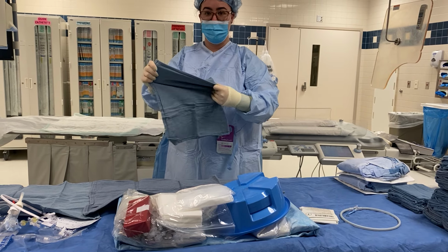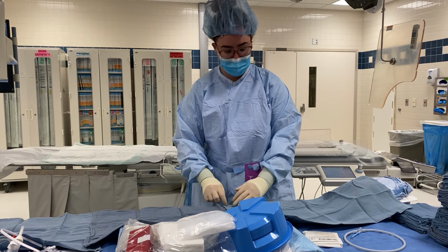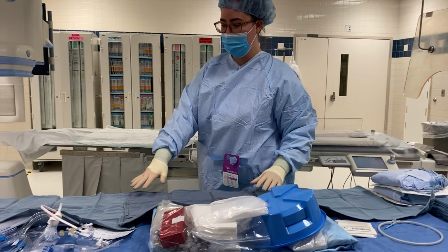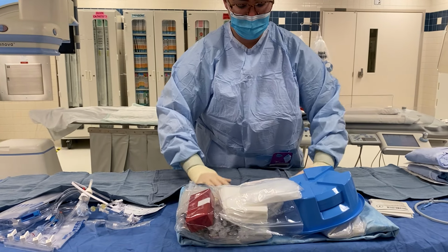Another advantage to having these towels is that during the procedure you have a place to hide supplies that you want to keep safe without falling off the table, but you don't want them getting in the way of everything else. So now that I have these all laid out, I can start laying everything else out that we need.